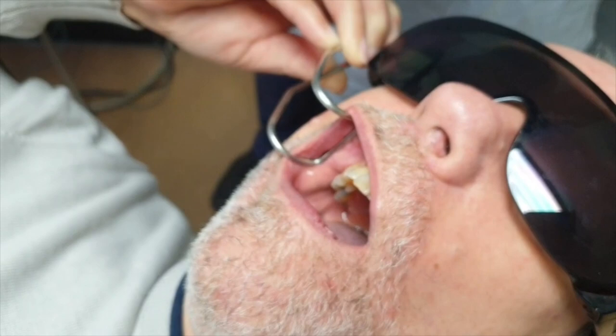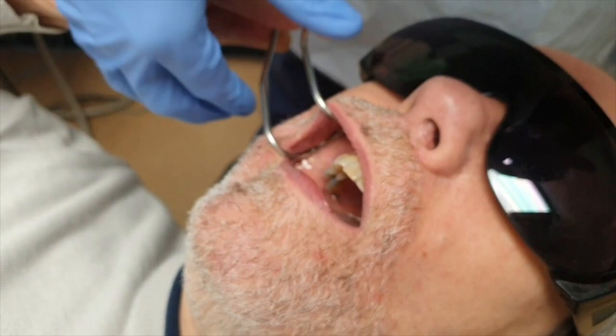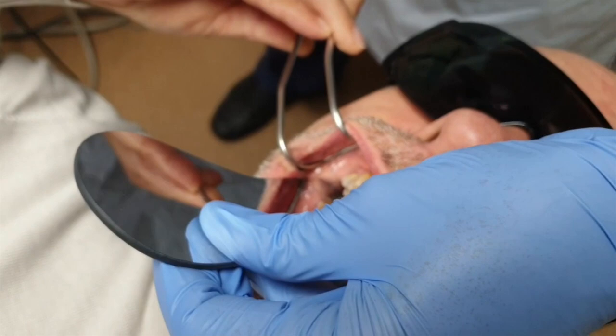We're going to grab a little bit more of that — perfect, brilliant. I got the patient to retract more of the cheek, and again we say show me the biggest opening that you can manage.